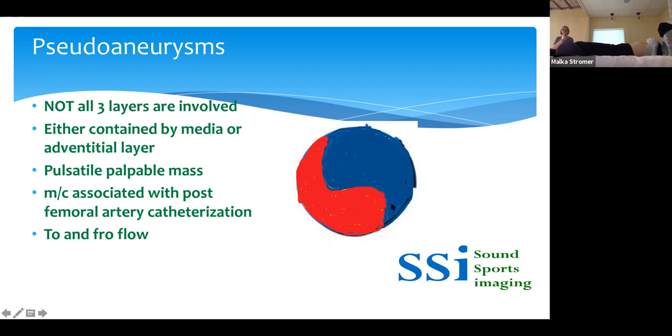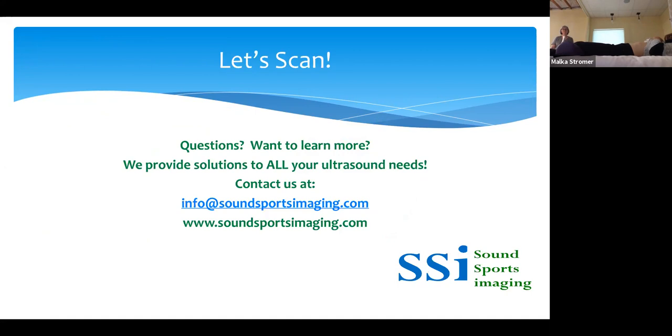Back in the day, sonographers used to treat femoral artery pseudoaneurysms by just putting pressure on the neck of that aneurysm with their transducer. Nowadays, they use thrombin to close it off. Okay, let's scan. I'm going to show you the technique of finding the aorta and the IVC.